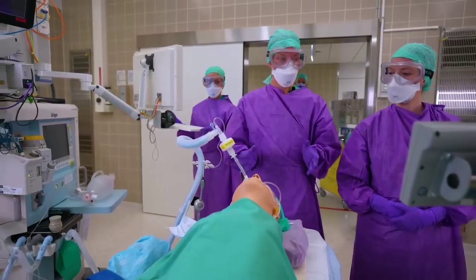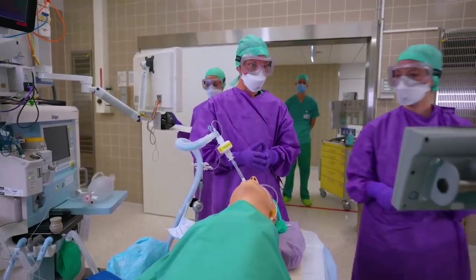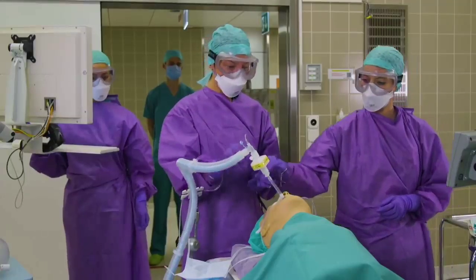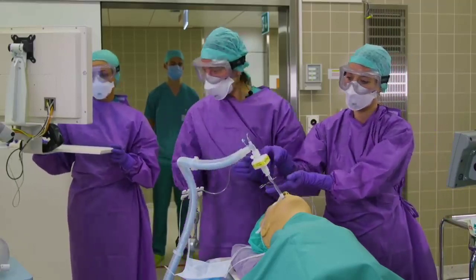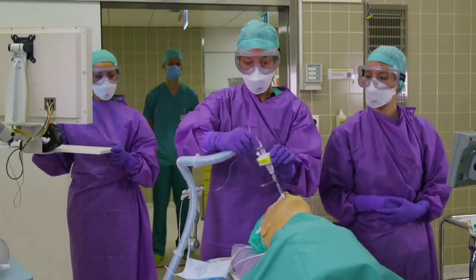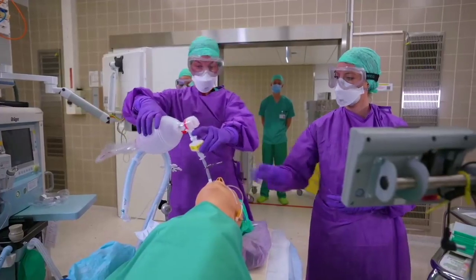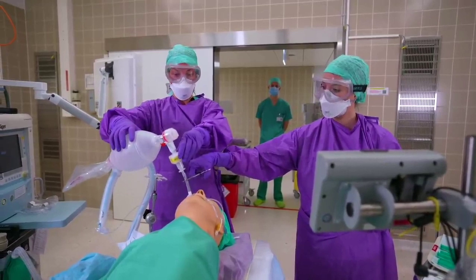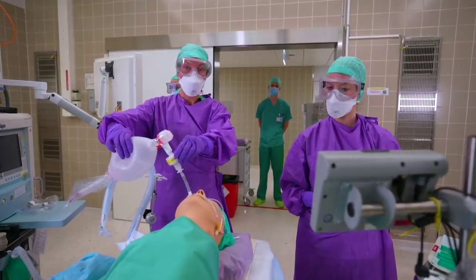If you're transporting an intubated patient to the ICU, make sure that you clamp the endotracheal tube in inspiration before you disconnect and reconnect to your bag-valve mask. We are saving our transport ventilators for use in the ICU, and hence currently we are utilizing bag-valve masking for transportation of ICU patients.